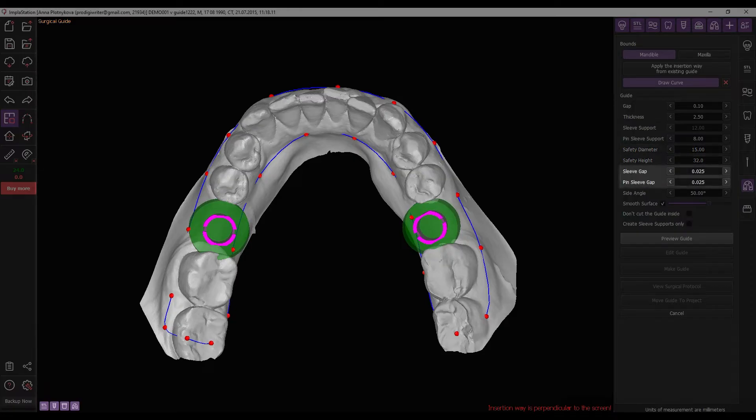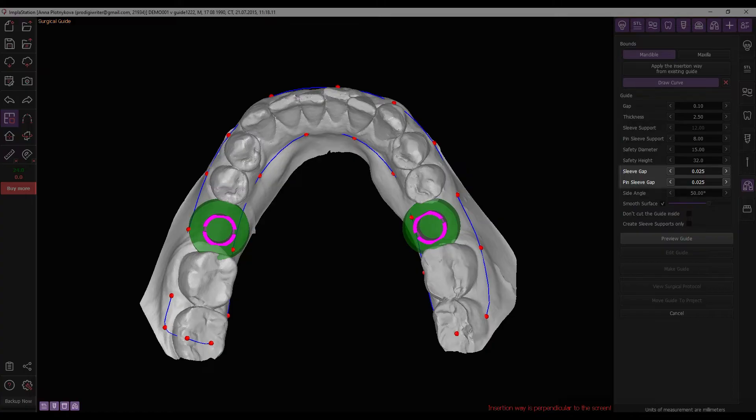Set the parameters for the gap between the guide and the guide sleeve, as well as between the guide and the pin sleeve, to account for any errors that may arise during printing or post-processing of the guide.